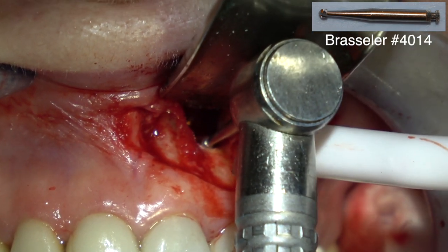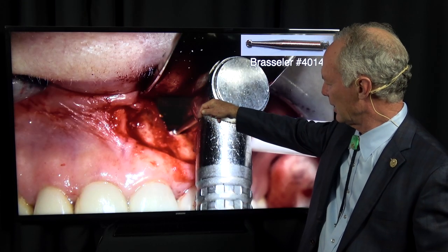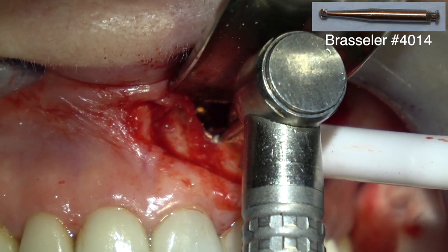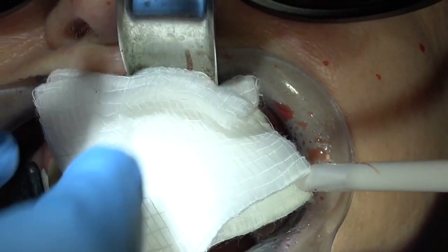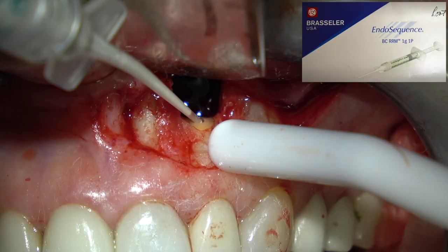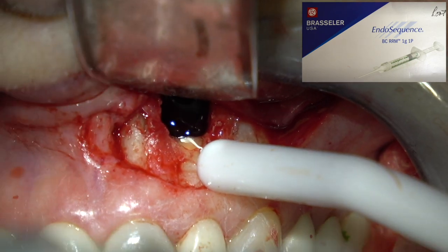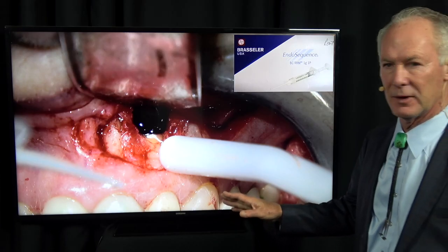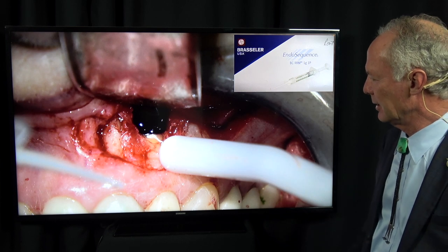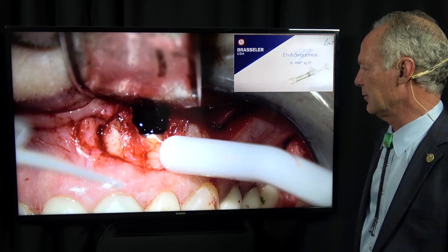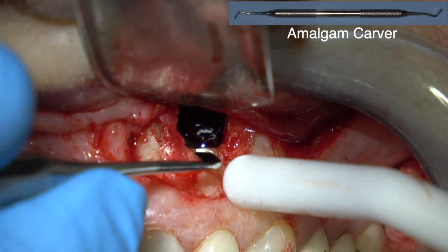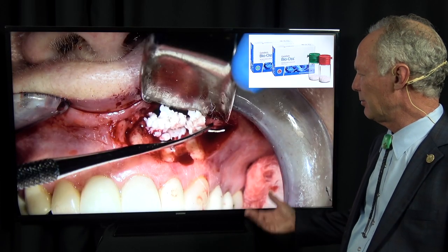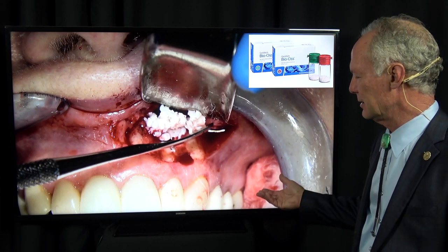The cut is at an angle, so I'm taking a small round burr and just making a little cut into the tip of the gutta-percha, creating a little foxhole. The hardest part is keeping this dry. I'm using root repair material from Endo Sequence. You can use gutta-percha; some people use amalgam, but I haven't used amalgam on anything in 40 years. IRM works, but this root repair material is designed for root perforations with endo — I've been using it for several years. It sets quickly, it's biocompatible, and water does not dissolve it once it sets.